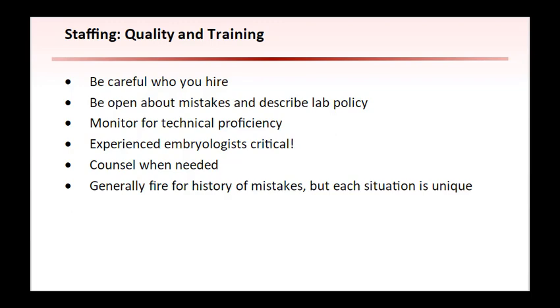Monitoring staff on proficiency should not be construed as a negative, but as a way of maintaining high levels of results. In addition, if an employee consistently performs a technique at a higher level, they can be used for training of new staff. Finally, if a staff member is unable to perform after all avenues of training have been attempted, or there is a history of nonconformances to protocols, it is prudent to consider removing that person from certain tasks.